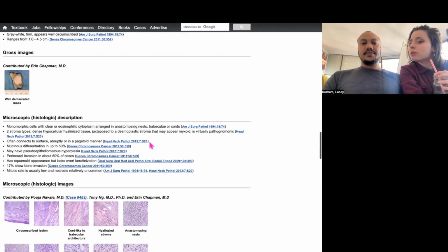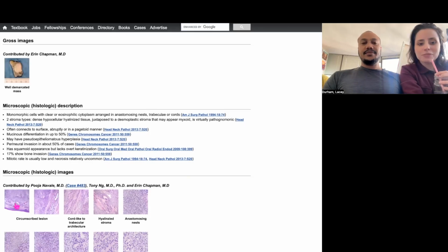Ooh, I think you're throwing with their mouse. Do you read like that with your mouse? For our followers. Hold on. Okay, hold on. Let me read it for myself.